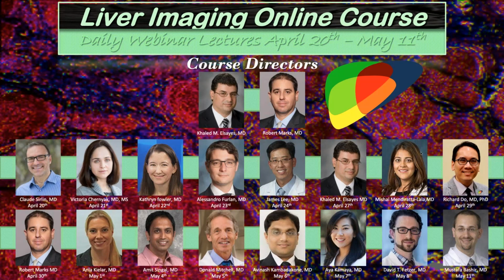So they switch, each 3 months, CT or MR, and after 3 months ultrasound, and then again a CT or MR, so that the interval between each CT or MR is 6 months. Do you think this is a good approach, or should we be more strict for LI-RADS 4 and ask for obligatory MR each 3 months? We do this because in Italy we have public healthcare, so it's a bit different compared to the US.